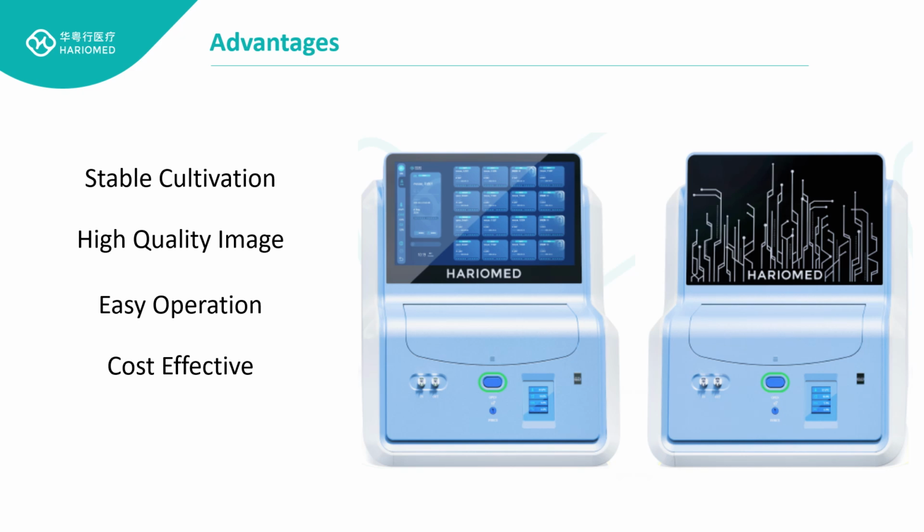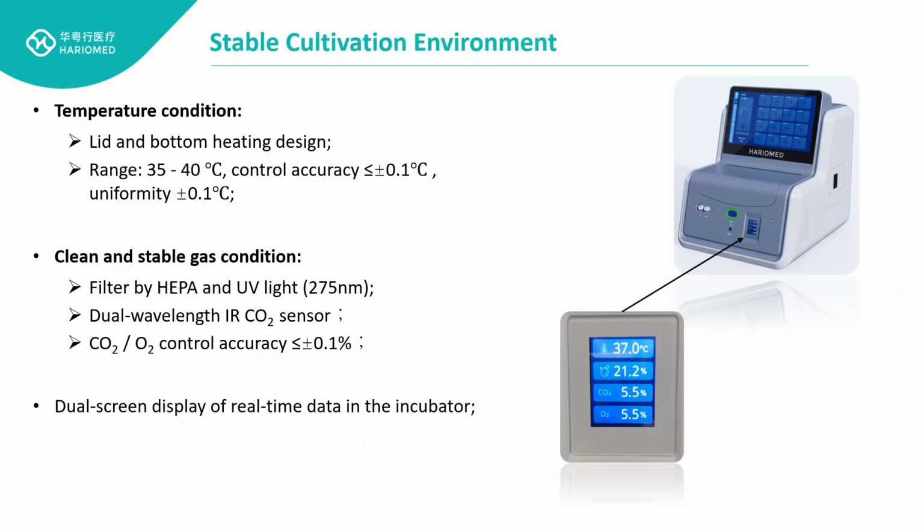Our time-lapse incubator has the advantages of stable, high-quality image, easy operation, and cost-effectiveness. So how do we realize those features? Firstly is the safe environment. For temperature, we design the lid and bottom heating to ensure the uniformity and fast recovery.